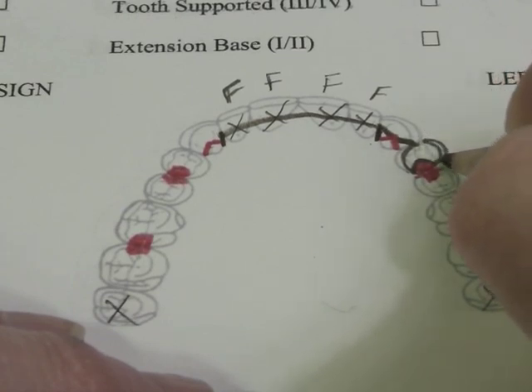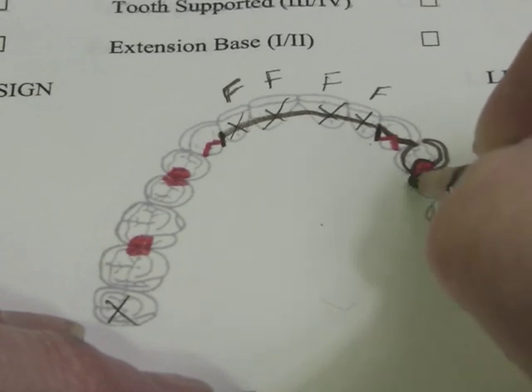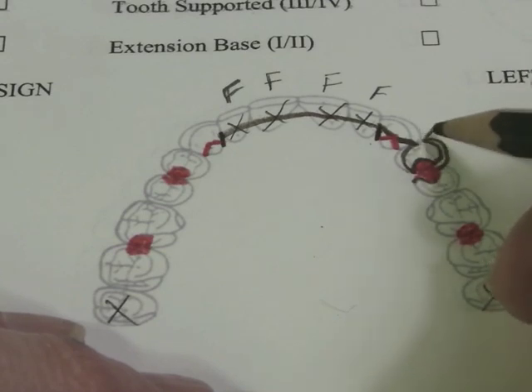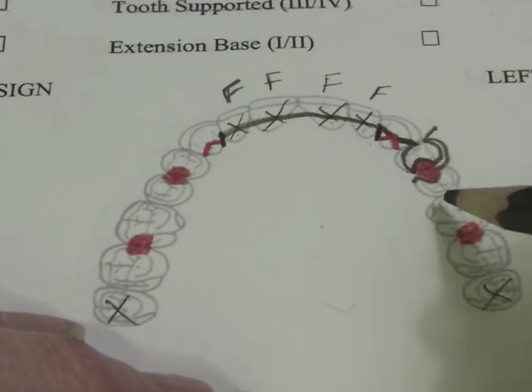We'll come down with the lower border. It comes up and circles this rest right here. And we show that that is the direct retainer side by placing a little crosshatch there.